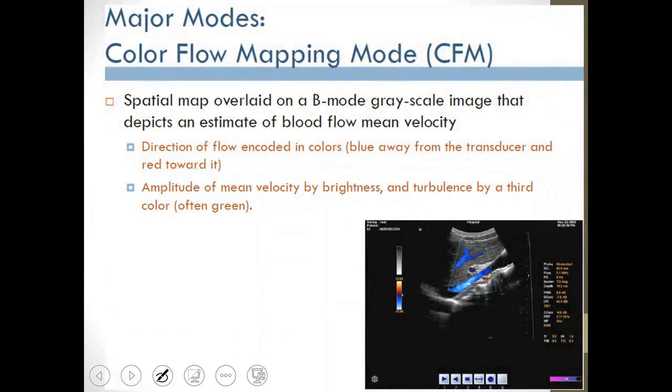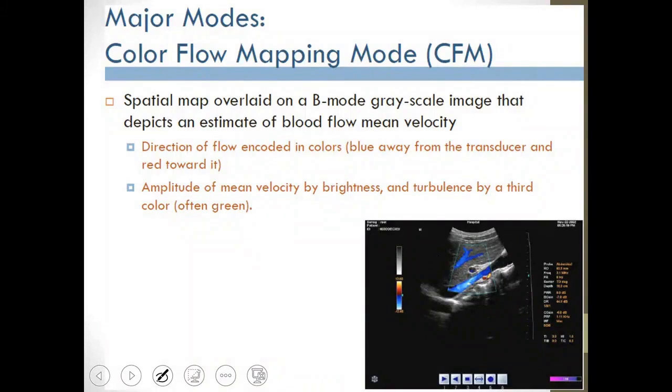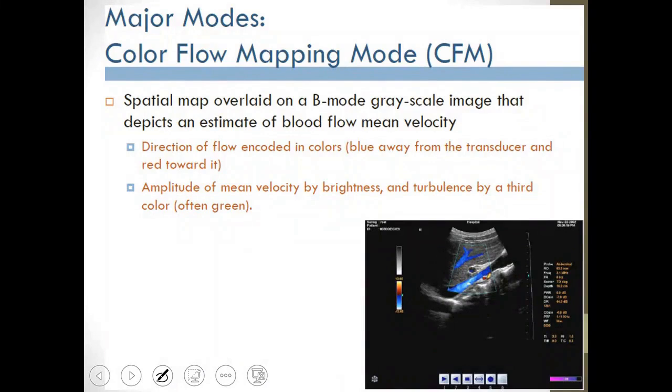There is something called color flow mapping. Here we were saying that we have identified the direction, which is important in medical imaging. Additionally, you need to know that there are areas with higher flow of red blood cells, RBCs, and areas with less flow of RBCs. This means that in certain places, such as these regions where there is high blood flow, this high blood circulation corresponds to an increased number of RBCs.